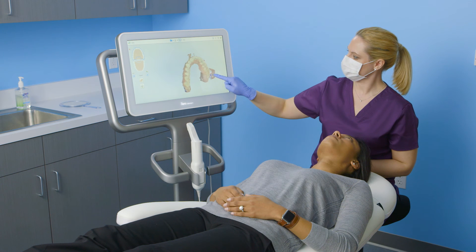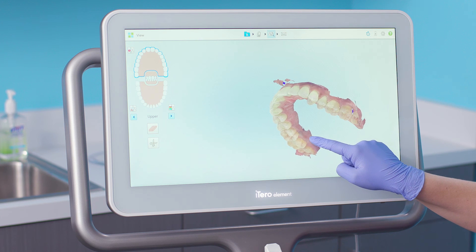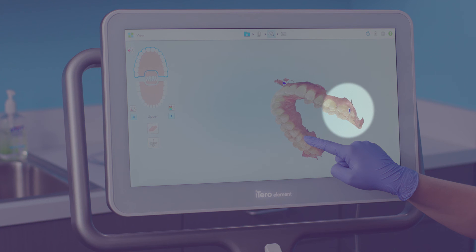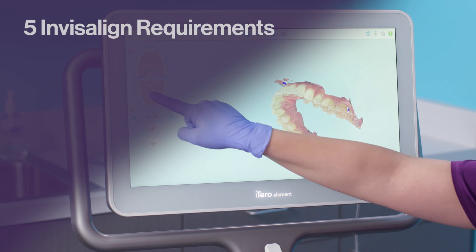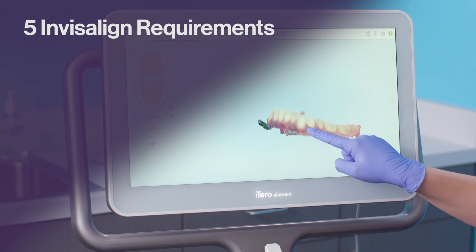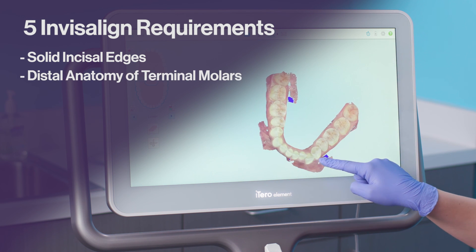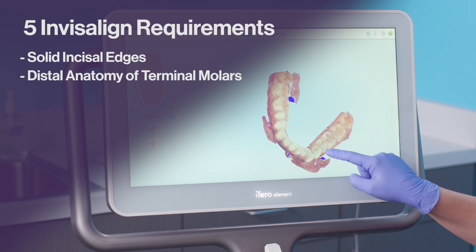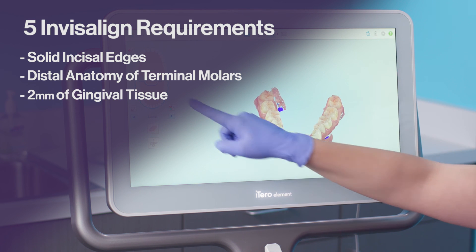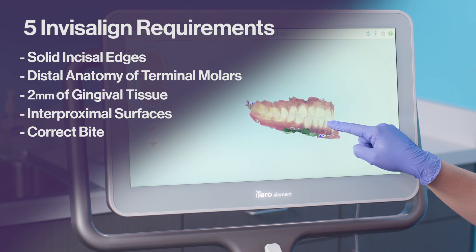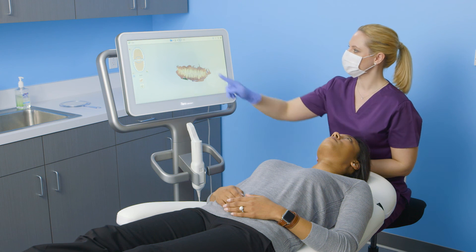If this is an Invisalign scan, I'll confirm that I have filled in any areas of missing anatomy. This will be indicated in red when I'm in monochrome mode, and purple when I'm in color mode. I will also confirm that the scans contain the five Invisalign requirements: solid incisal edges, the distal anatomy of the terminal molars, 2 mm of gingival tissue, the inner proximal surfaces, and the correct bite. When I'm satisfied with the digital model, I will send the case.